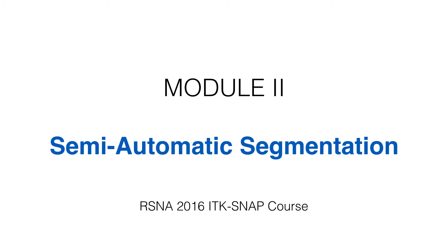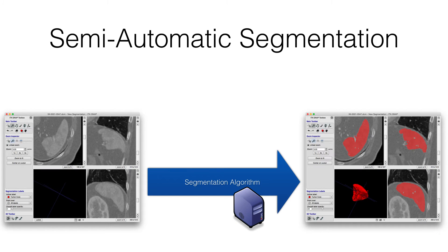We'll start the second part of the course, which is about the semi-automatic segmentation. The semi-automatic segmentation, in contrast to what you've been doing, Snap itself will do a lot of the filling in of the segmentation of interest.